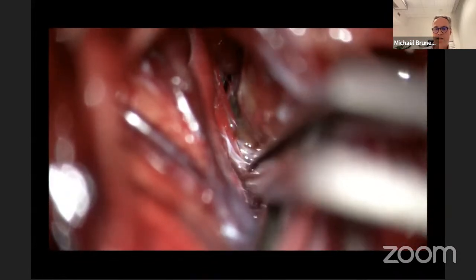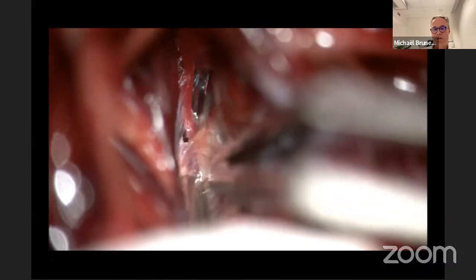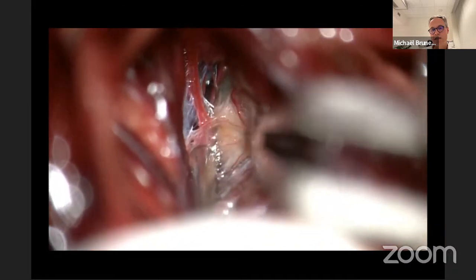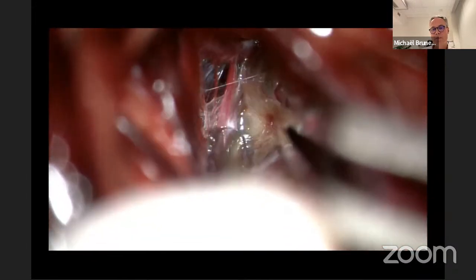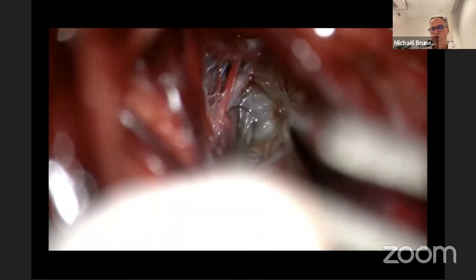Then the dissection of all the perforators is of crucial importance. And now you see how the cavernoma extends along all those vessels. Careful separation, no retraction, no blade. Perfect vision. I almost don't use the bipolar, just the forceps to do it.